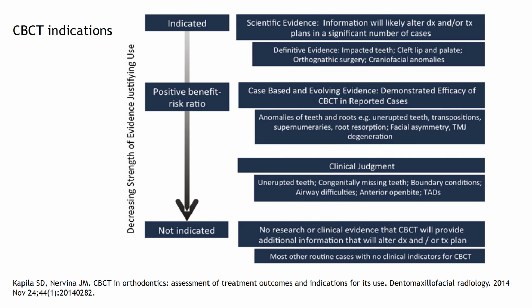So this is a chart of assessment of treatment outcomes and indications in orthodontics, and it is evidence-based. It's only indicated when you have a significant number of cases with impacted teeth, cleft palate, orthognathic surgery, or craniofacial anomalies. It's important to assess the benefit versus risk ratio, and in cases where there is enough information available with two-dimensional imaging and no clinical indicators for CBCT, it should be avoided.